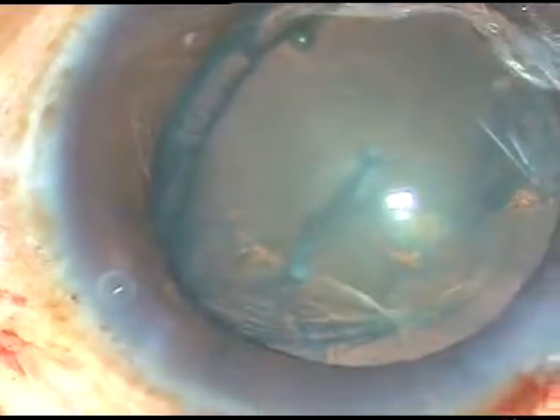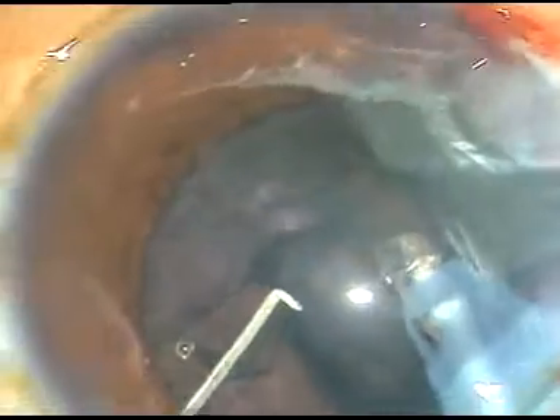Viscoelastic substance has been placed. Now it's time to attack this prolapsed nucleus. One area including the equator has been emulsified. The nucleus tumbles and very minimal ultrasonic energy is required to emulsify this nucleus. In no time the nucleus is taken out.